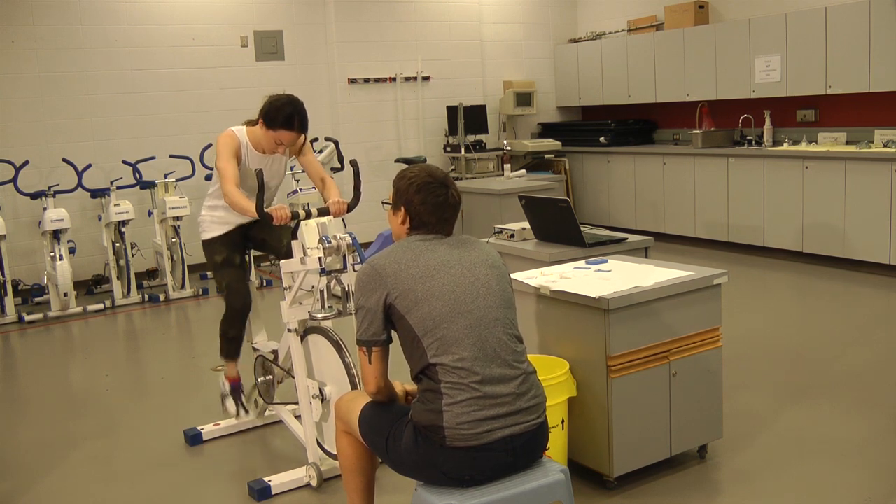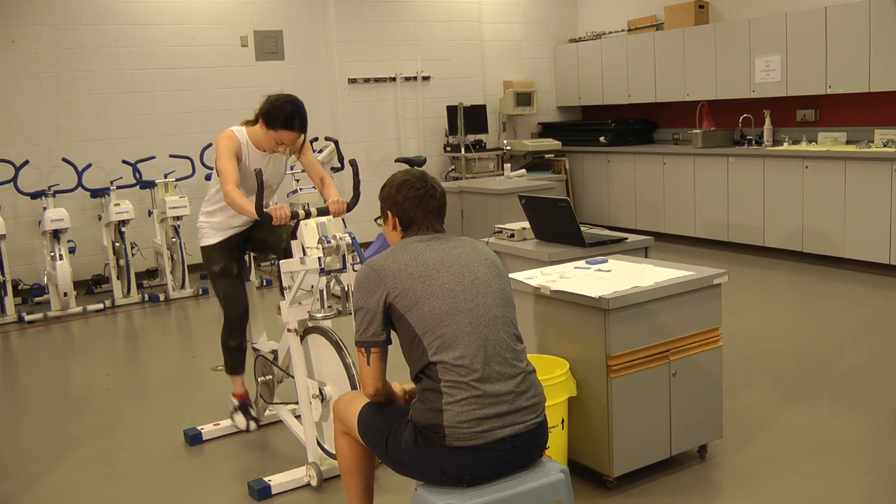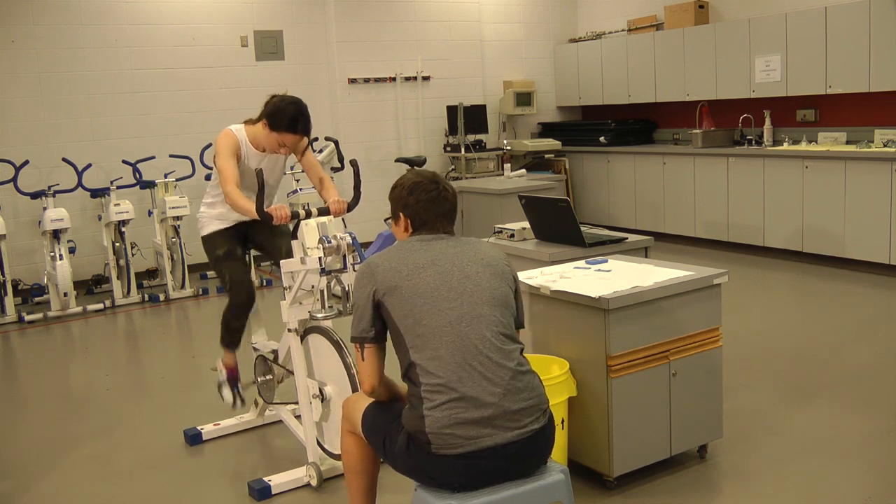Ready? Yeah. Five, four, three, two, one, go, go, go — as fast as you can.